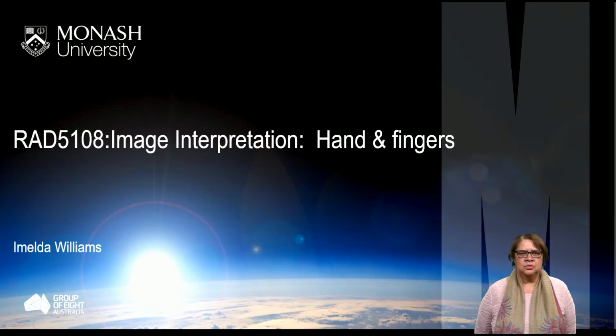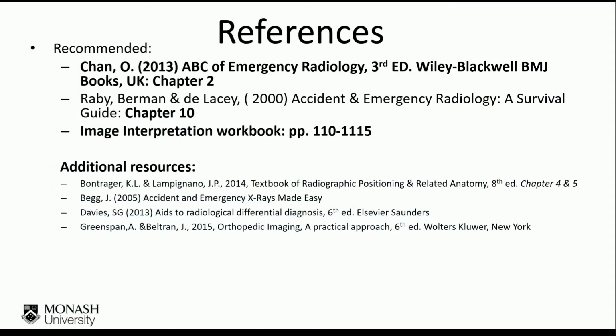Today I'm going to talk to you about image interpretation of the hand and the fingers, and as usual the focus will be on traumatic conditions. I've highlighted some of the references that I've used for this presentation.